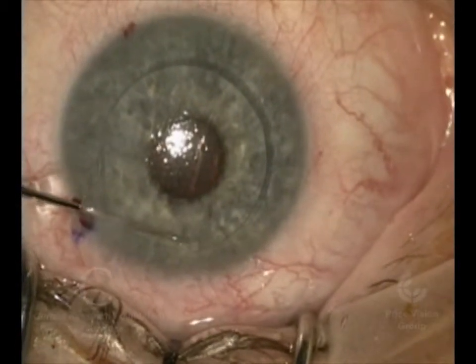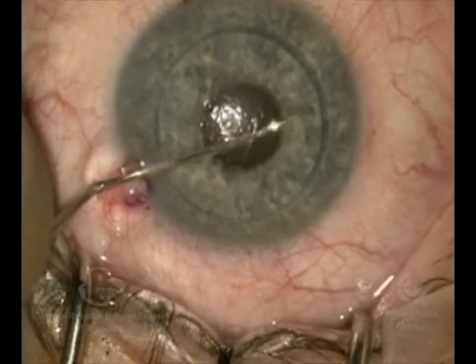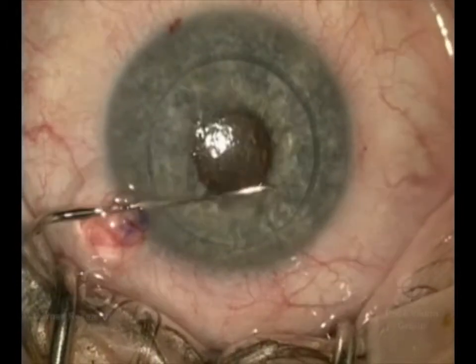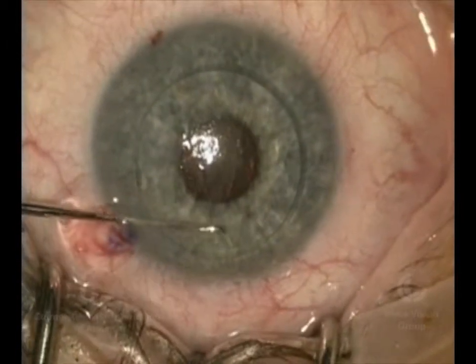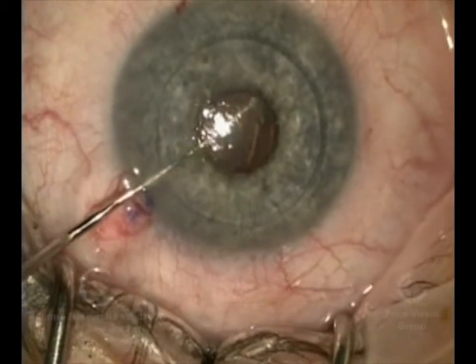This maintains the anterior chamber so that we don't have as much risk of damage to the natural lens, as we do not want to cause a cataract prematurely. So we're going to strip off Descemet's Membrane from the patient — the diseased Descemet's Membrane.